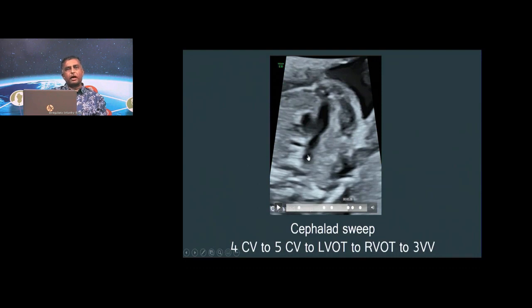You only have the pulmonary artery and the ductus arch. You have in long section the short section of the aorta, and you have the SVC here. That's the trachea, which is actually dividing into the carina over here. It's actually bifurcating into the 2 bronchi there. So this is a 3-vessel view.